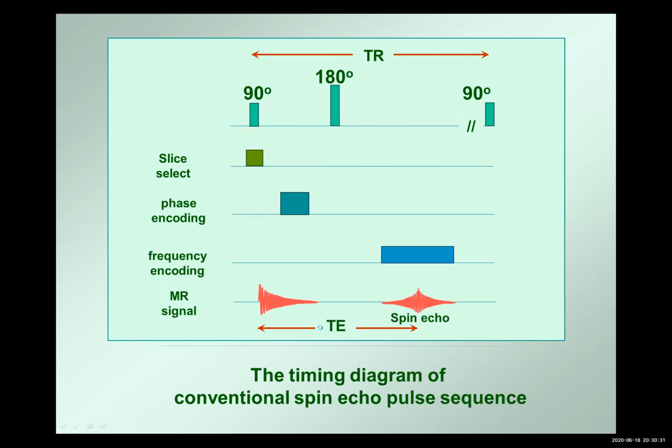So this is how an MR image is acquired. It's a repeated process. You acquire 90, 180, then get a new k-space line. And then you excite again, similarly, but with different phase encoding, with a different gradient strength, as you can see. This is repeated 128 or 256 times.